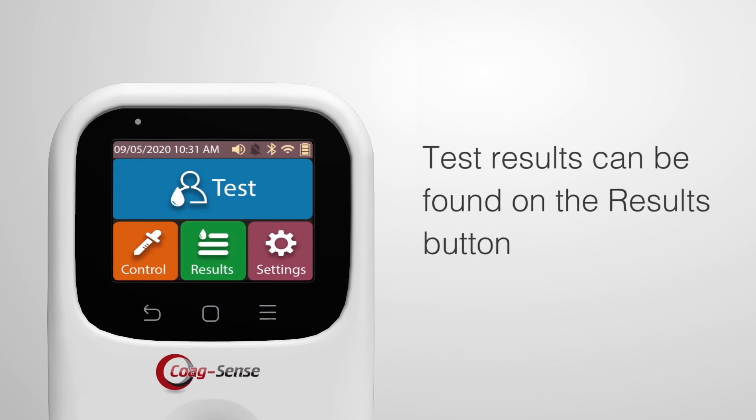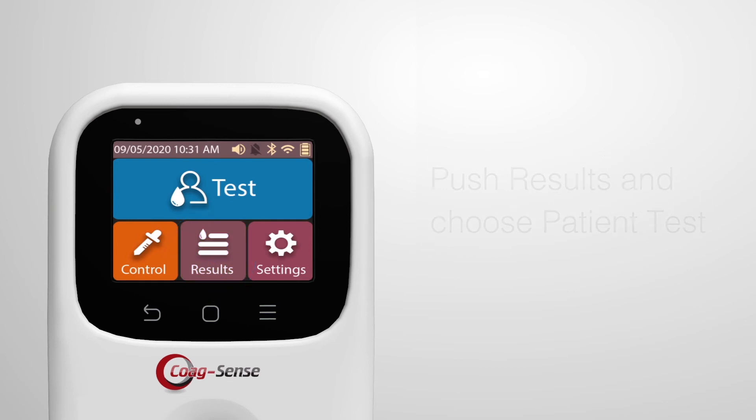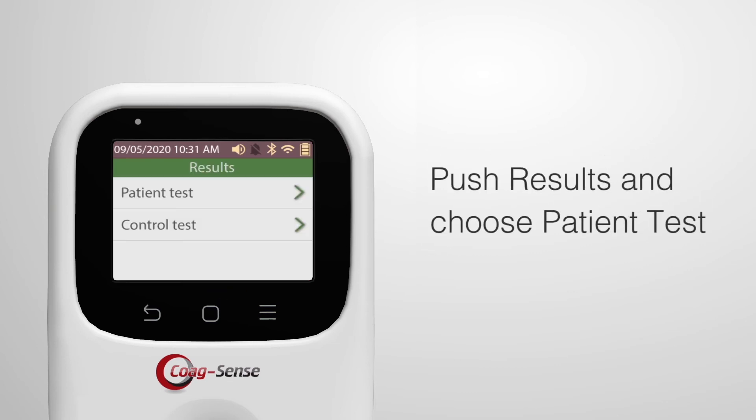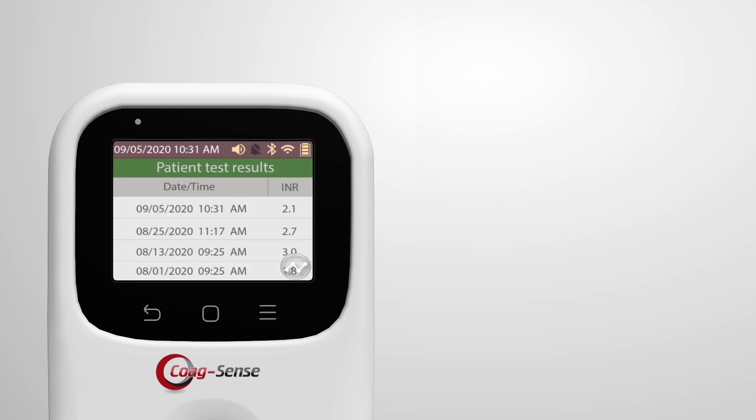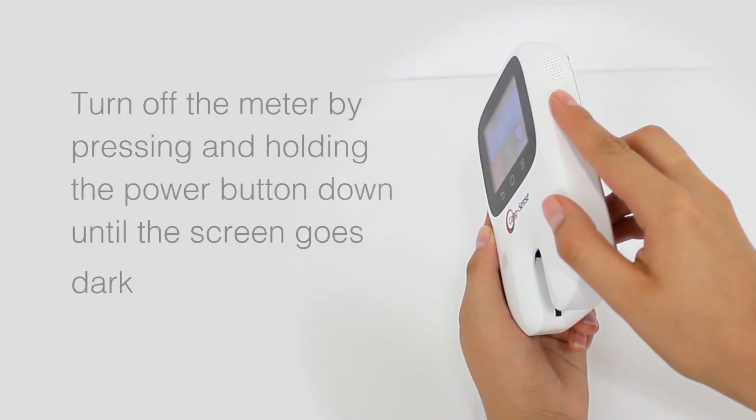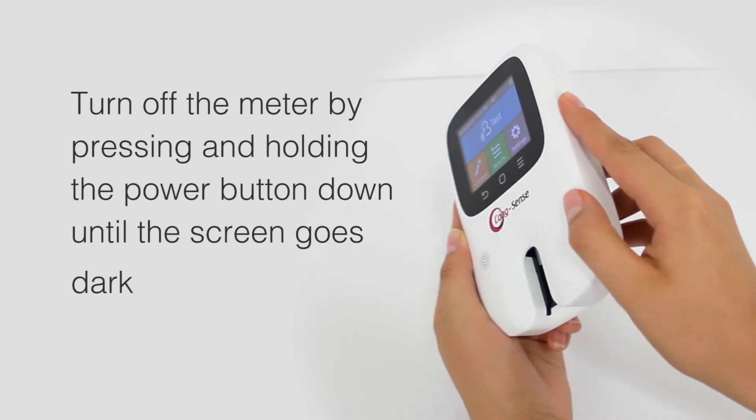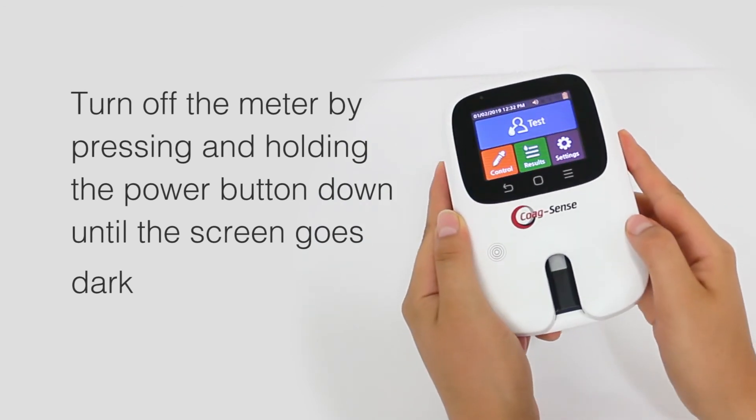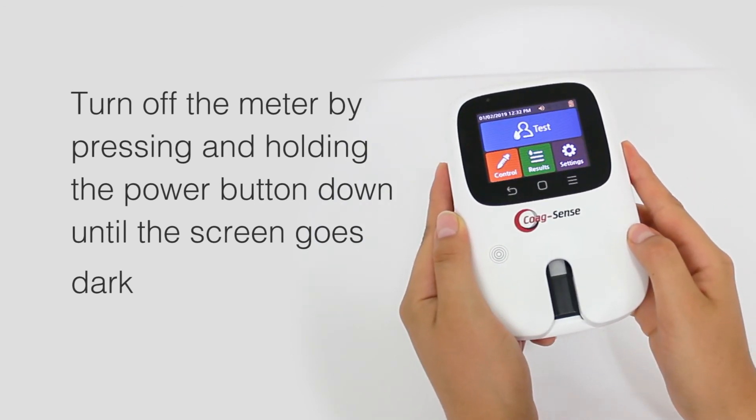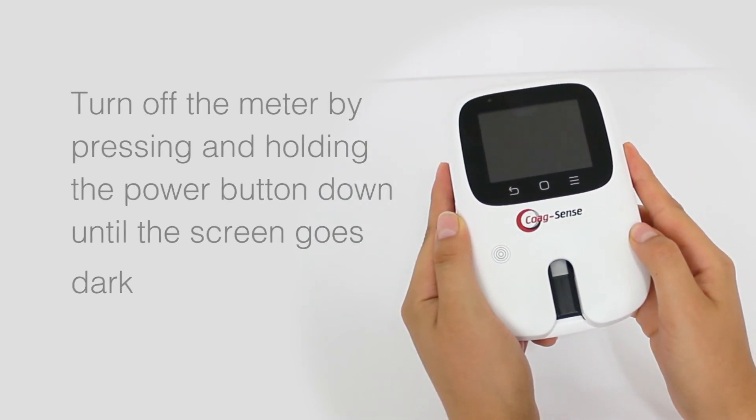The test result is recorded in memory and it can be found on the main menu using the results button. Push results and choose patient test. Turn off the meter by pressing and holding the power button down until the screen goes dark.